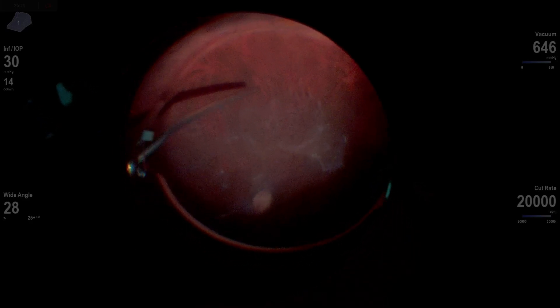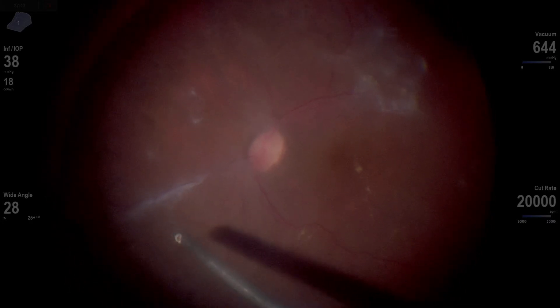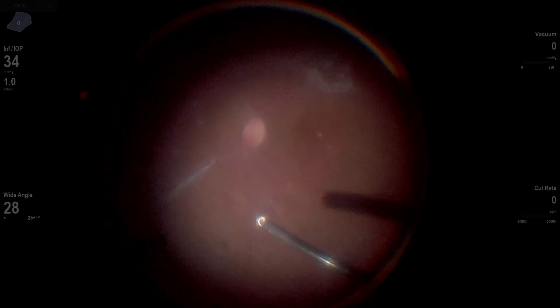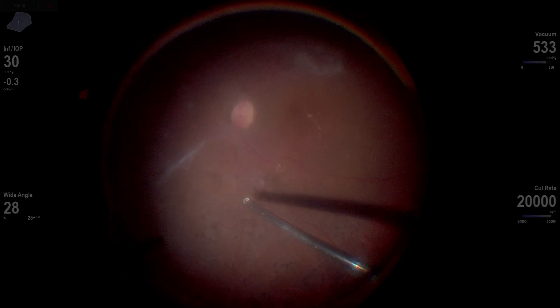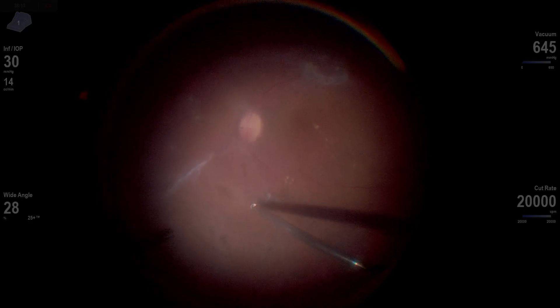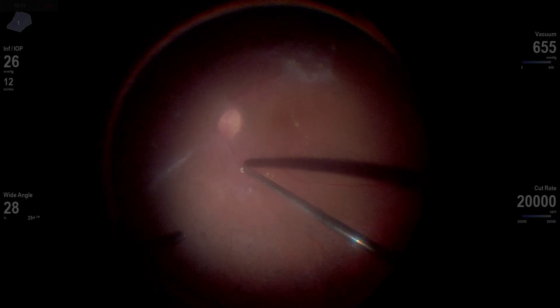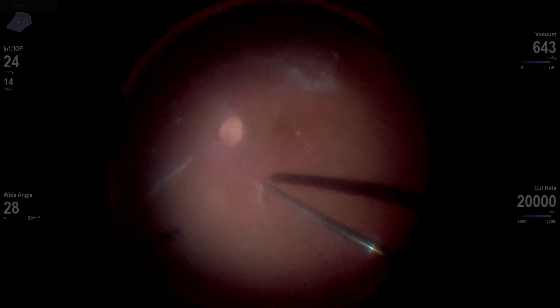I'm working diligently along it. I don't put forceps in the eye in this case — I like forceps for peeling fibrotic tissue, but mainly if we have a good access point over the optic nerve, and this was just really too plaqued down. So I'm going to use my cutter here as a forcep and as a pick, actually using it to get under this vitreous tissue. This tissue is a little more translucent and difficult to see, but I can see how the retina responds around it. As I get under it, I can see I'm lifting something up, and now my goal is to get enough space to get my cutter in there and start to segment.